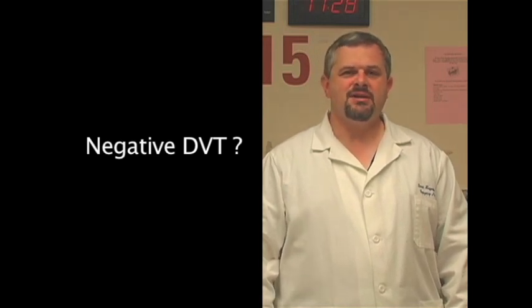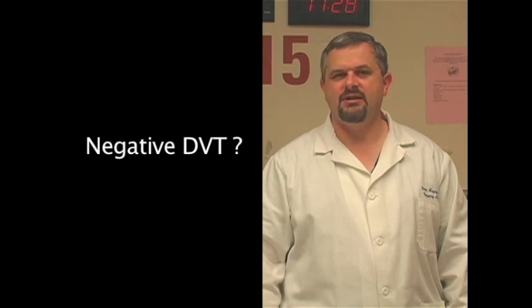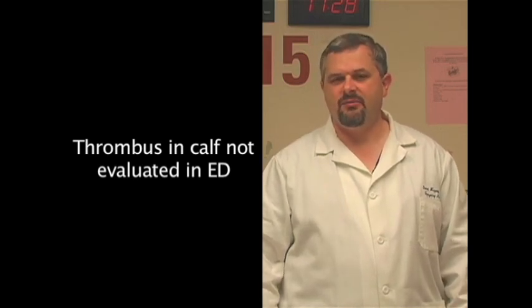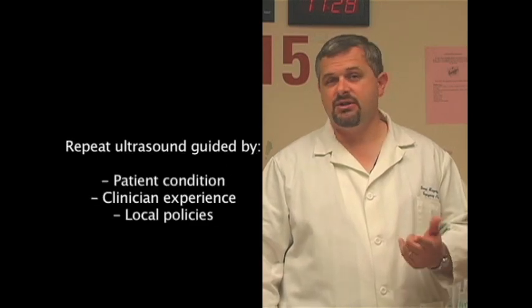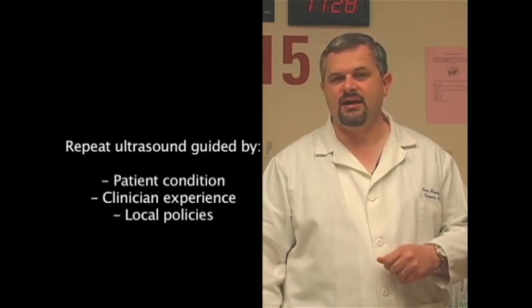Some controversy exists without significant consensus about the management of a negative emergency department ultrasound during the evaluation of DVTs. The possibility of a calf thrombus is not evaluated in the emergency department ultrasound. Therefore, patient condition, clinician experience, and local policies should guide the use of repeat ultrasounds 4 to 7 days later.